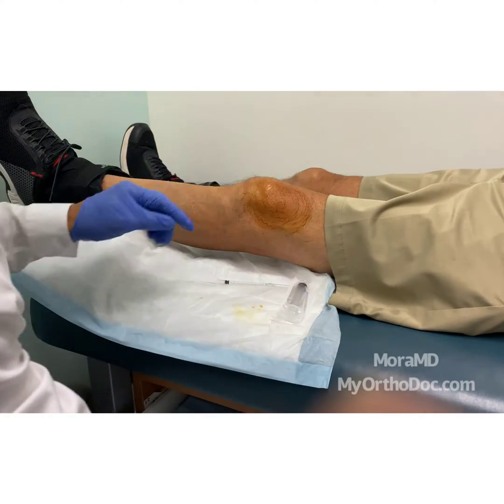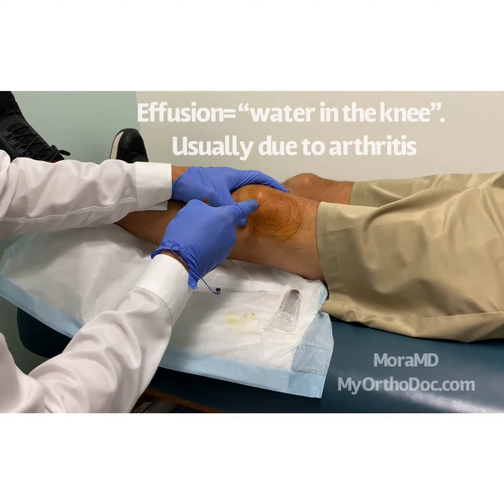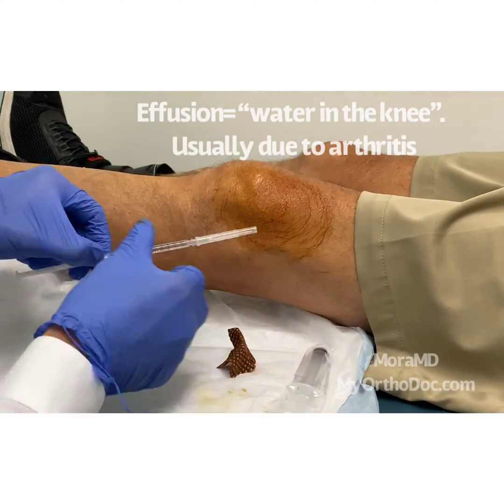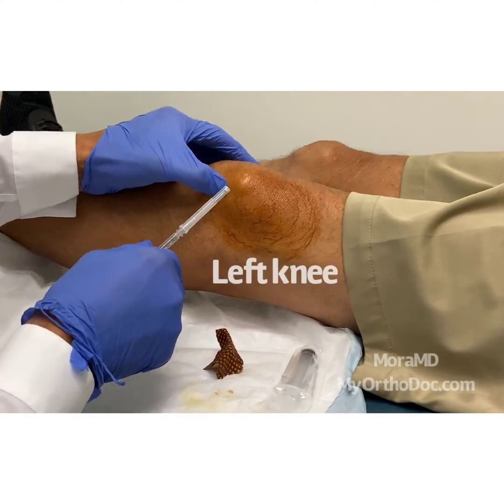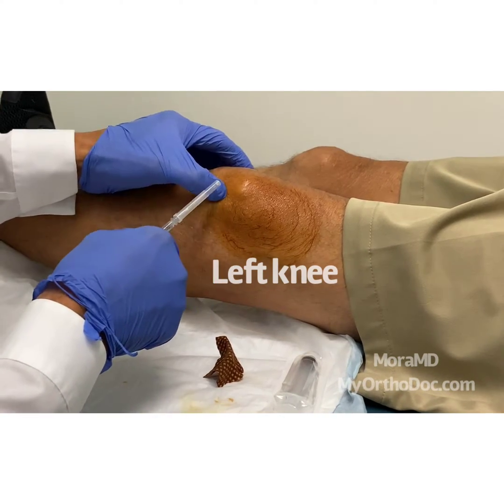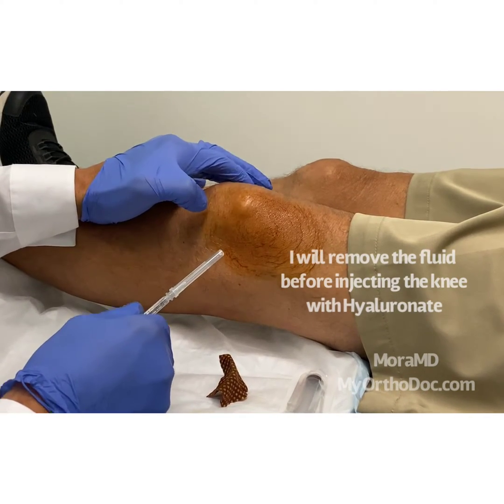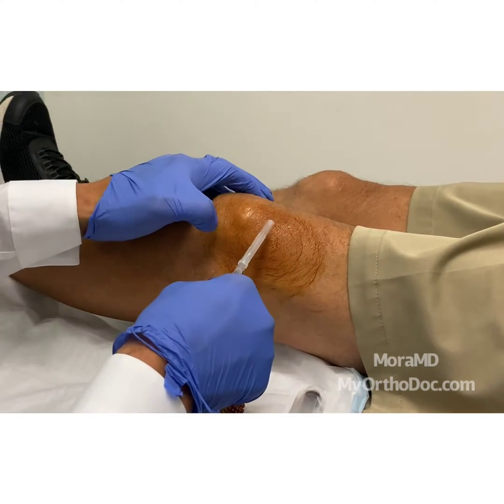What we're going to do one more time is inject and aspirate this effusion — it's called an arthritic effusion. Here one more time are the landmarks: the lateral border of the patella, the superior border of the patella, and the quadriceps tendon. When you push the patella this way, you can actually see the shadow of the quadriceps tendon.